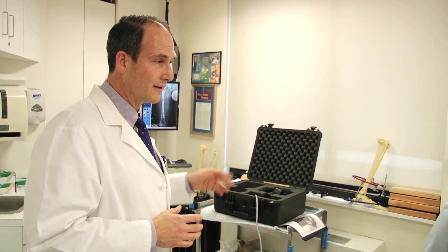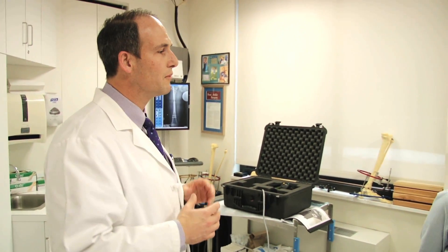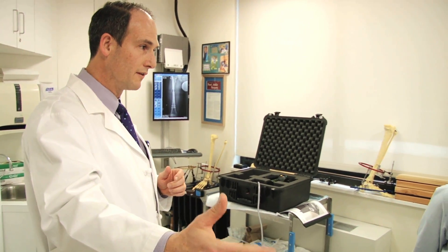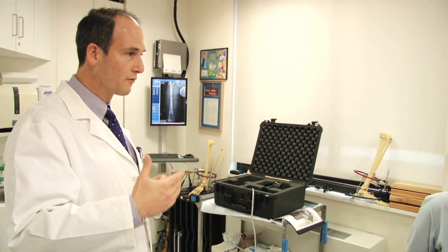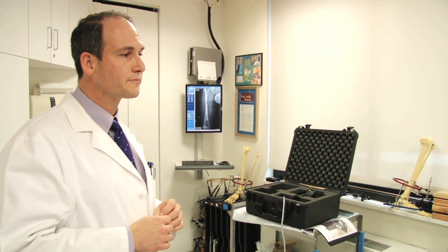This is a strong magnet. It's not like Magneto — it's not going to pull your refrigerator across the room — but it is a strong magnet. If you have something magnetic 12 inches away, it'll actually pull it. So if you had a knife or something metal very close, it could pull it over and that could create a dangerous situation. So take my watch off for this? Right.